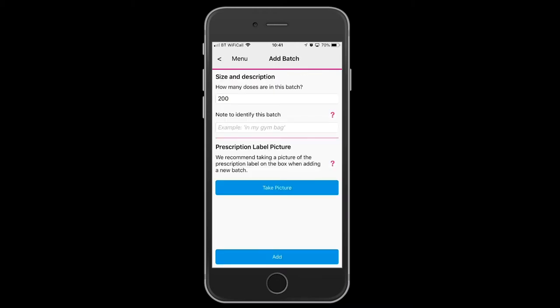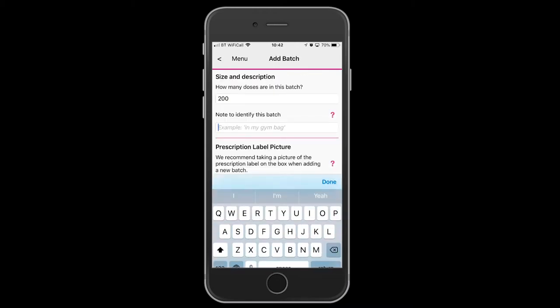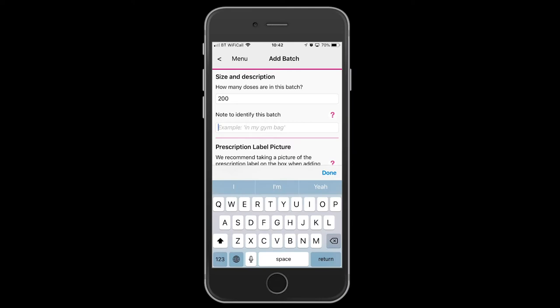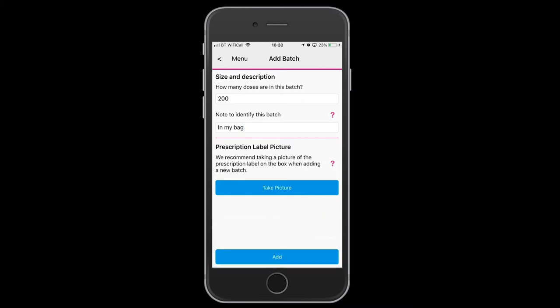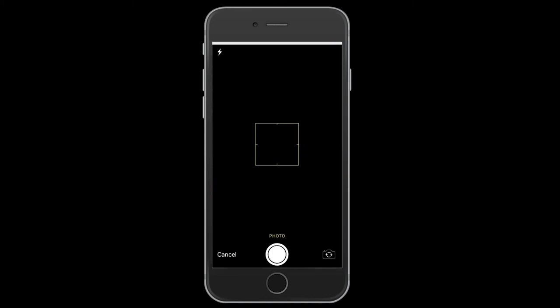Now you need to add your first batch. You need to list how many doses are in that batch and where your batch is located — in the bag in this case.